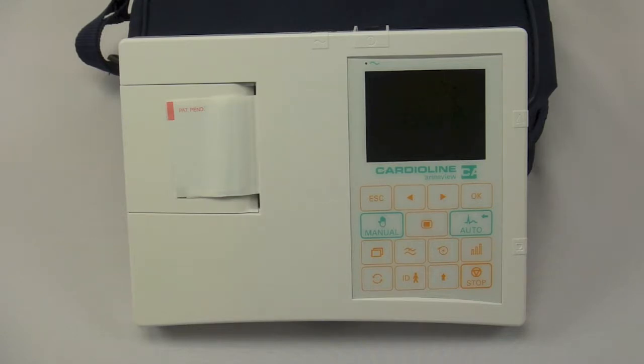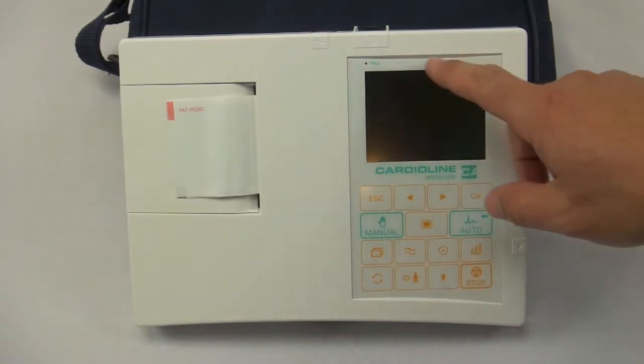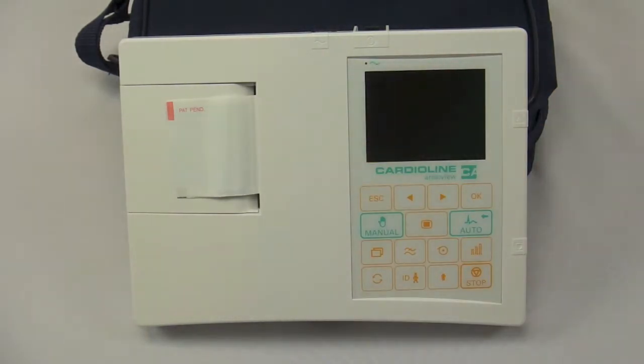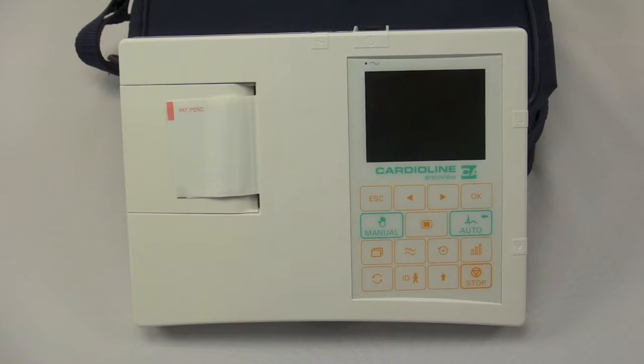The first is the AR600 ADV, which does not have a preview screen like this particular unit does. It would just have a small strip screen that would allow you to set the machine up for usage. The machine in front of you is the CardioLine AR600 VIEW, meaning it has a preview screen and allows you to view the waveforms prior to printing.